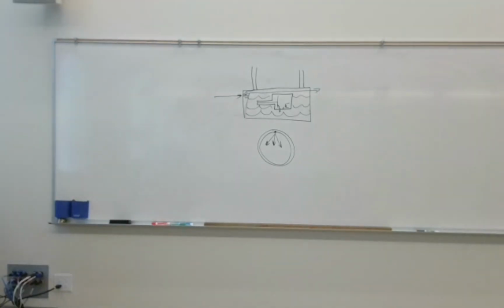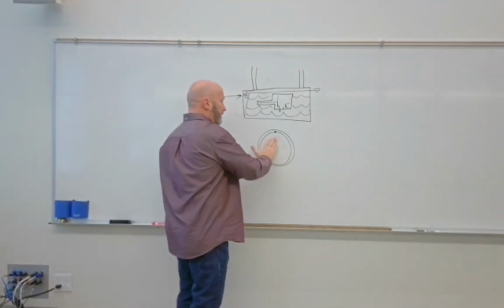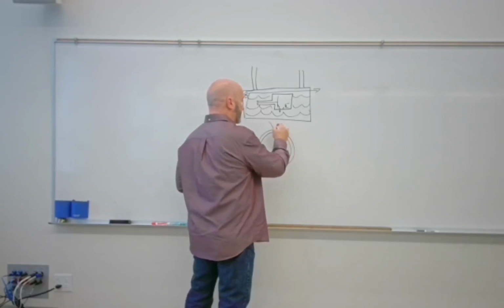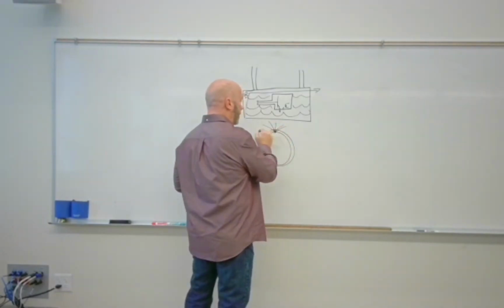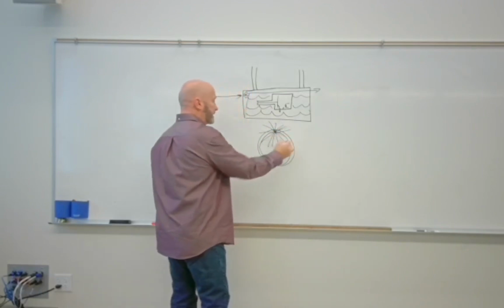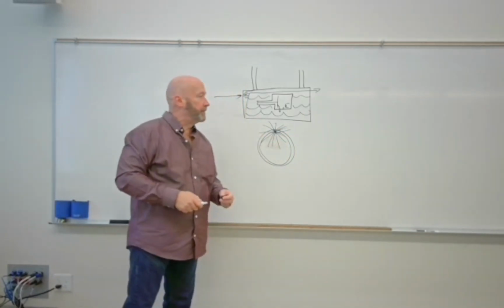So where we have X-ray impact on our anode, our X-ray creation is such that the X-rays try to go off in all different directions with equal intensity. So try to imagine that being three-dimensional instead of two-dimensional.